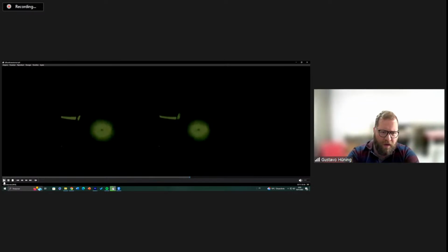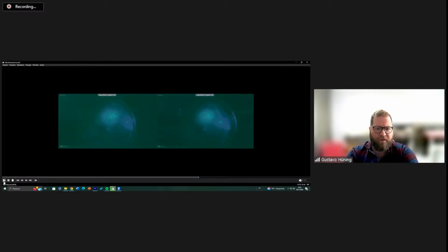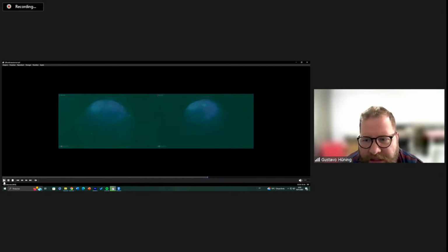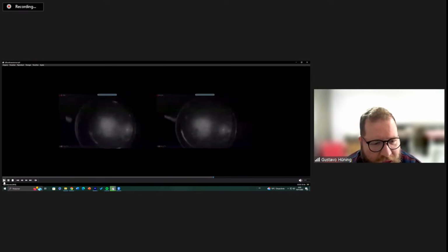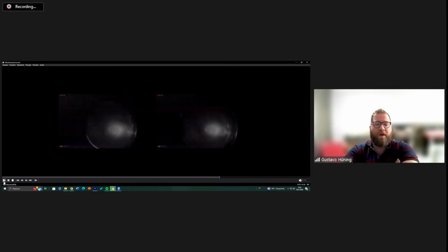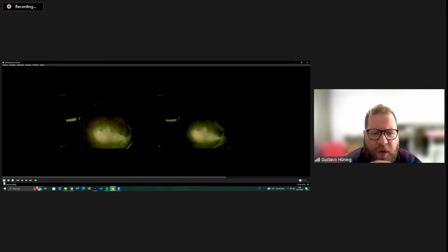This is the original green one. This is a patient who wasn't as bad as the other one, but full of ischemic areas, hemorrhage, and microaneurysms. In these cases I had my two brothers. One does glaucoma and the other cornea, and they said, no, we are not taking part in retina cases. Yes, today you will. So we were playing and looking for which would show us better.